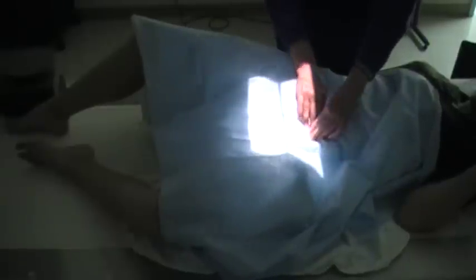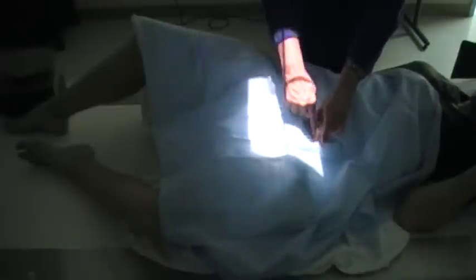The Lowenstein method is slightly different in that you lay the leg out all the way on its side. It's easier when the patient bends the opposite leg to help accommodate that. Lay that leg all the way out on its side and then you're going to have to relocate your hip to make sure you're still centered. Palpate ASIS, locate the pubic symphysis, draw your imaginary line and then go down two and a half inches. That is the Lowenstein method.